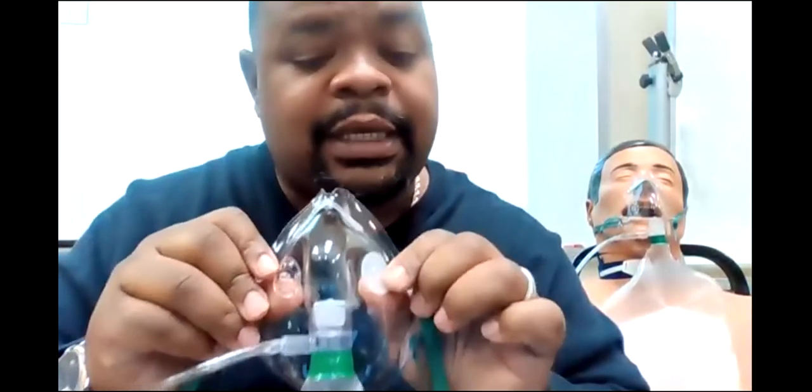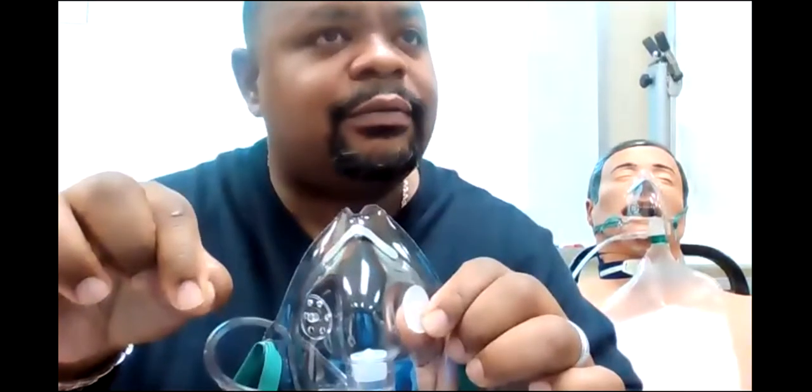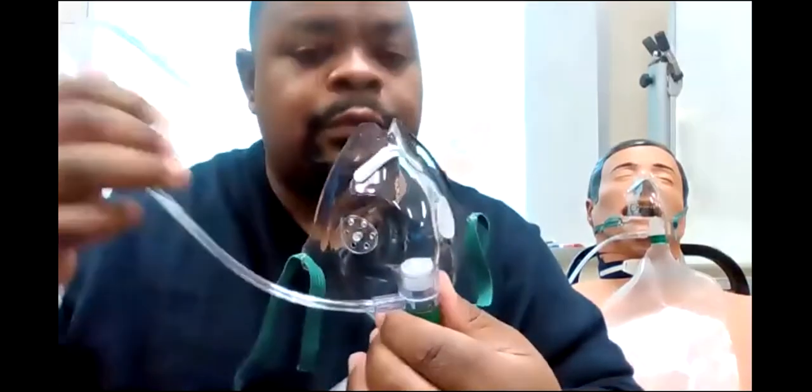Now, you say, well, what about the other side, Mr. McCarthy? Yes. Both sides, when you buy this new, it comes with one on both sides. But the manufacturer or the hospital will make sure you remove one. Why would I remove one? Think about what would be the reason why I would want to remove one. To prevent suffocation? Because just in case the bag's not working right or the oxygen is trapped or something.